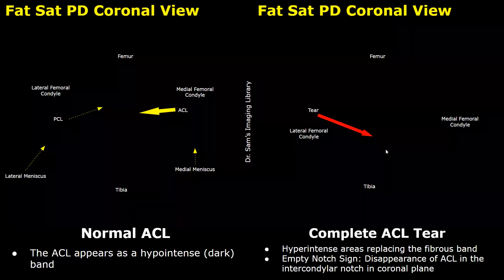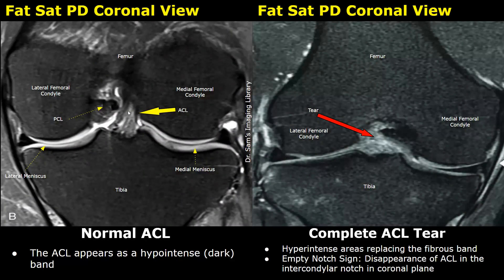This is a fat-saturated proton density weighted image in coronal plane. We can see the normal ACL — this fibrous band is the ACL. In case of a complete ACL tear, this region will be filled with hyperintense areas. This disappearance is called the empty notch sign, which refers to disappearance of the ACL in the intercondylar notch in coronal plane.